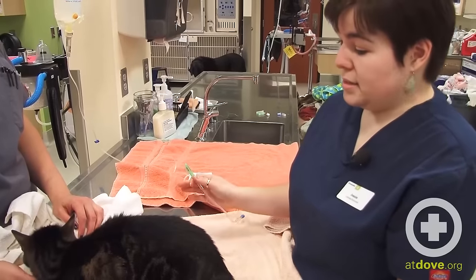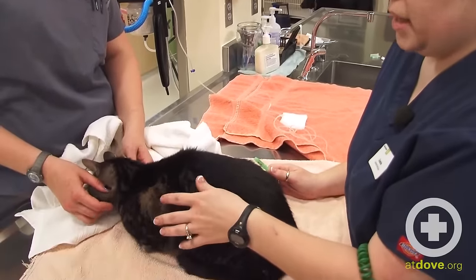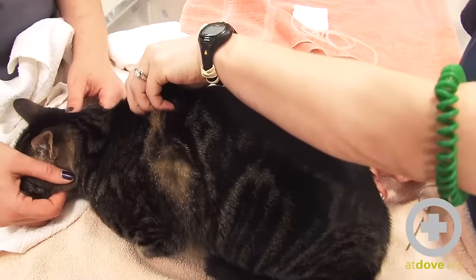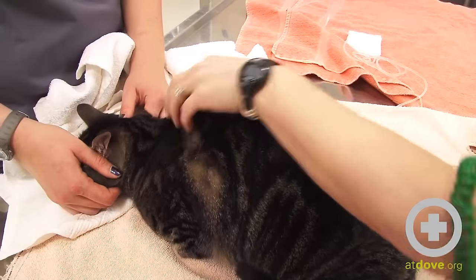Now that my fluid administration set is set up, we're actually going to give the sub-Q fluids. The best place for that is right here in between the shoulder blades. This area tends to have a lot of extra loose skin and can easily tolerate a lot of sub-Q fluids put in one location.